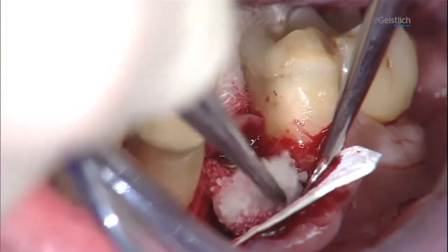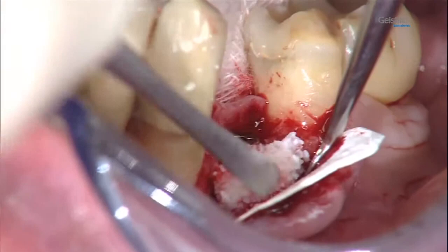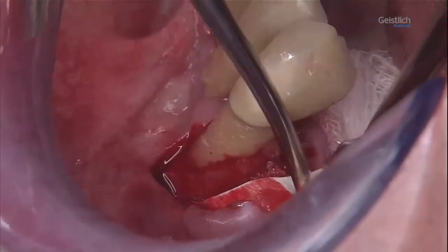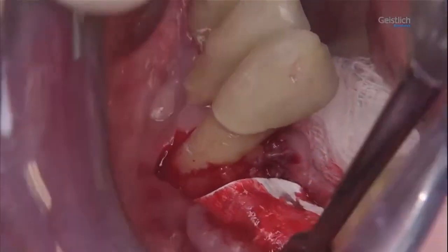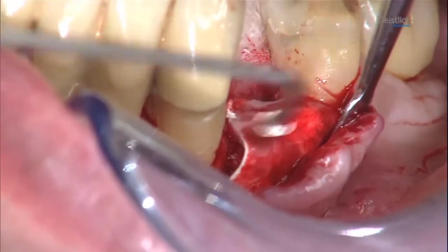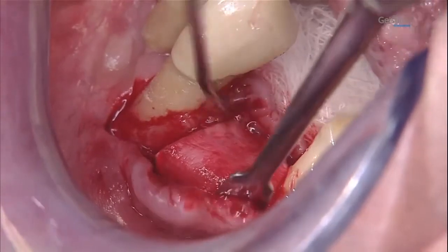The block absorbs liquids very well and is easily divisible and moldable. These properties make the introduction of the bone substitute material into the defect considerably easier. Here we have created a small disc shape, which, after its introduction into the defect region, may be further shaped and pressed into place with a suitable instrument, such as a bone rasp.